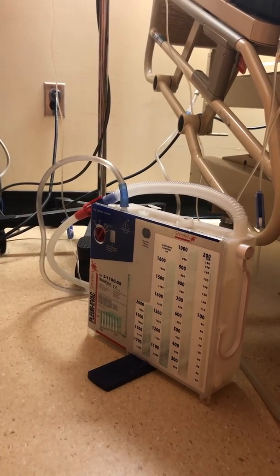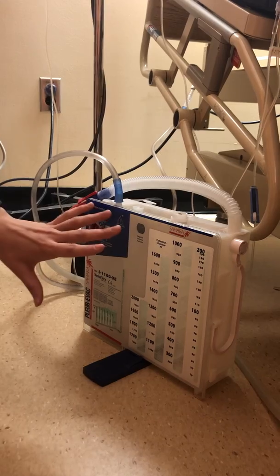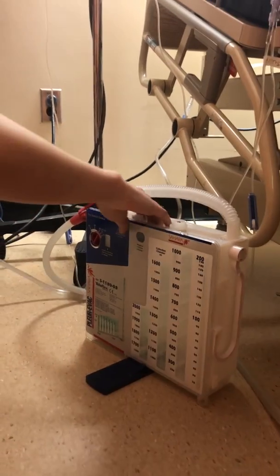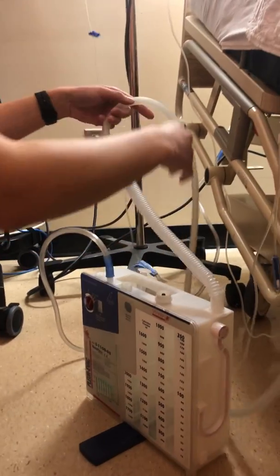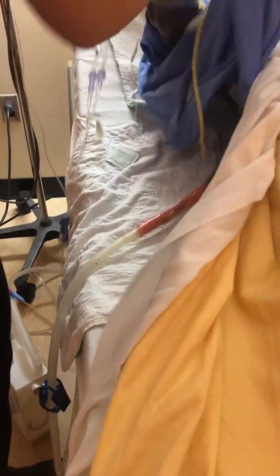There's just regular serosanguinous drainage, minimal amount. I would mark that at the start of my shift, so everything looks good there. Now I'm going to follow the rest of the line up to my patient, make sure there's no kinks, nothing is plugged. So Bryce, I'm just going to get you to lift your arm here, please.